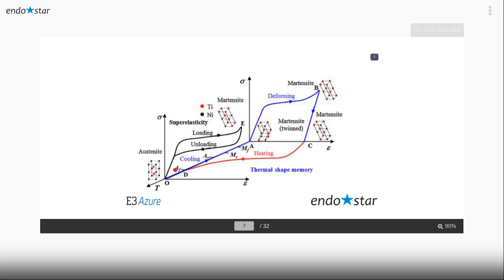So here you have the austenitic phase wire under heat process. It transforms, and we have here AS and AF. This will return again when we come back from here to here. But we have here martensitic start and martensitic finish, which is the matrix of the alloy, mainly martensitic phase.